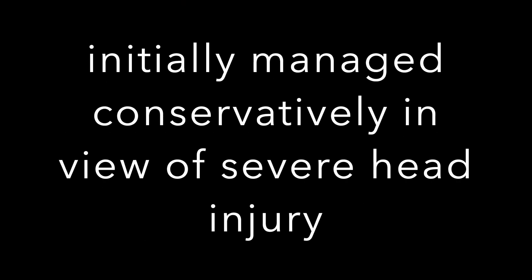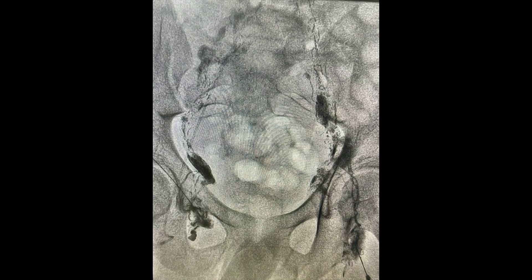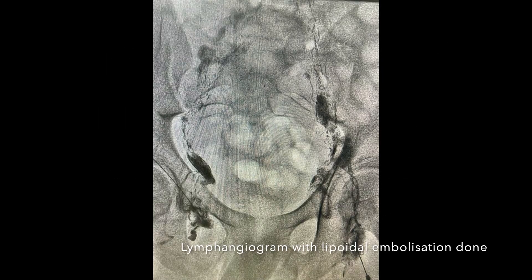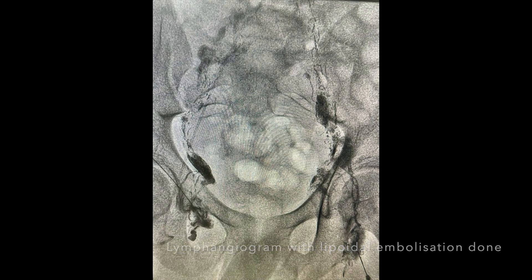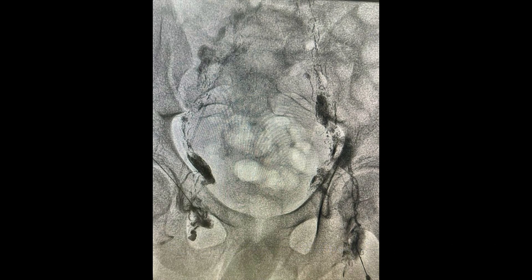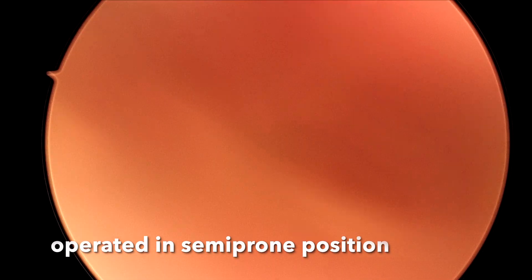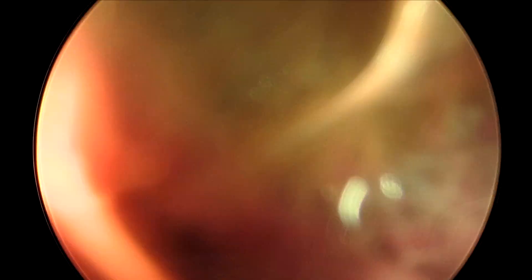In view of severe head injury, the patient was initially managed conservatively. However, the output was persistently high. After initial stabilization, the patient underwent lymphangiographic embolization. However, the output continued to be on the higher side — more than 2 liters — so the patient was planned for thoracoscopic exploration.